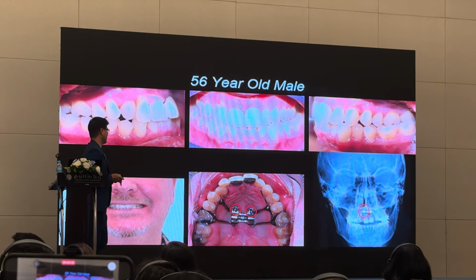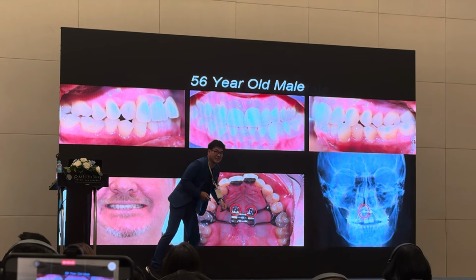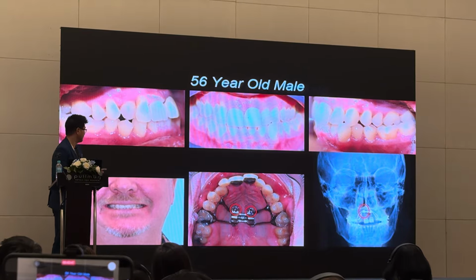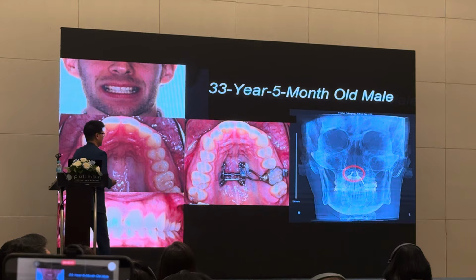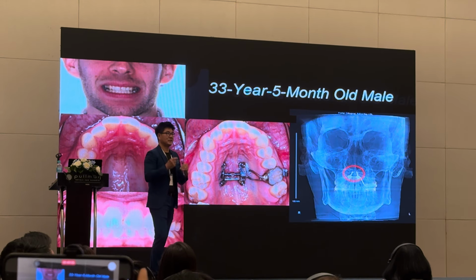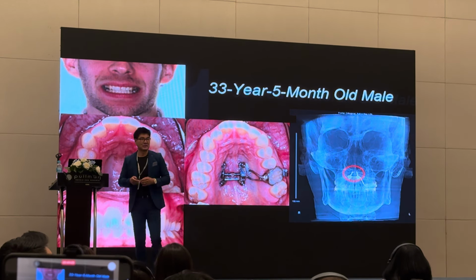Another one, this one. You can see monocortical engagement, screws very long, sticking out, right? Couldn't get them up all the way. So, again, we couldn't split the suture. Another one. None of the 4 screws are bicortically engaged. See the severe tipping? Okay. Now look at this. Terrible.